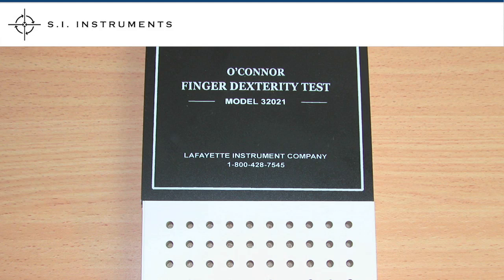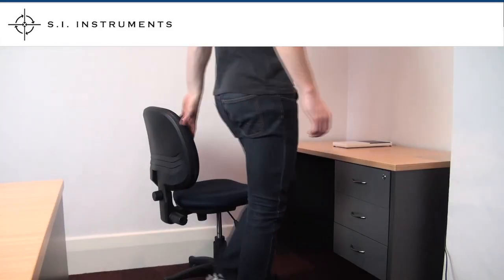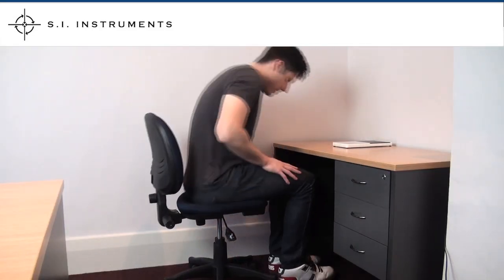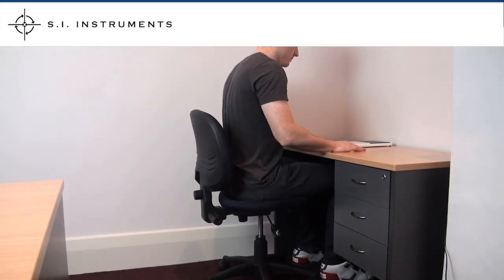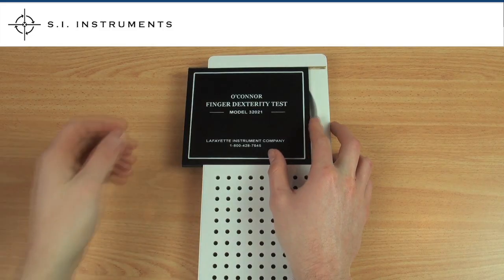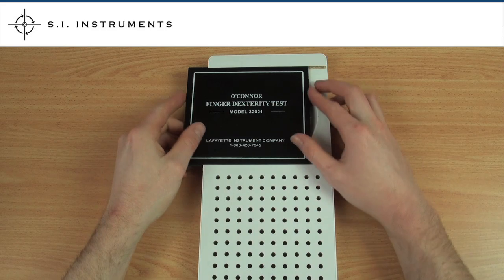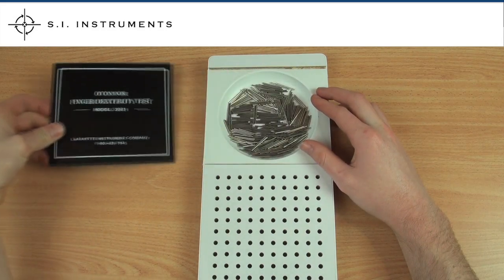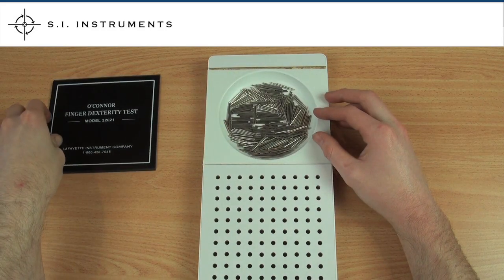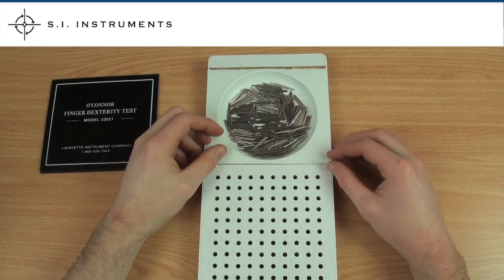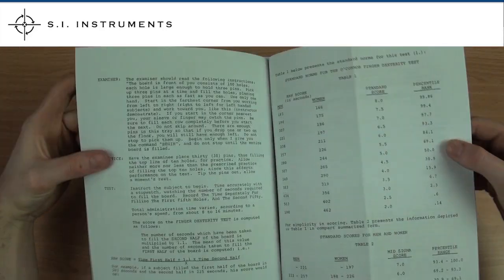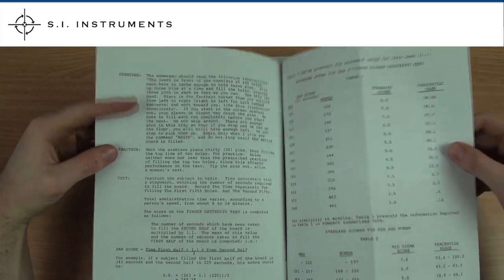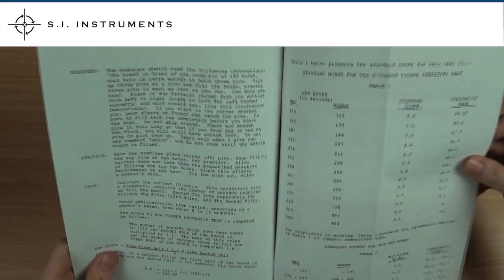O'Connor finger dexterity test. To begin this test, the subject should be seated comfortably at a table measuring approximately 75cm in height. Place the test about 30cm from the table's edge and to the subject's right if he or she is right handed and vice versa. When ready to begin the test, read out the instructions provided in the manual to the subject.